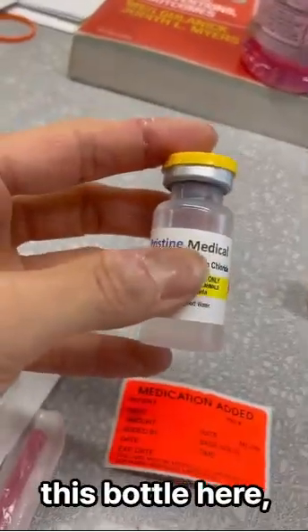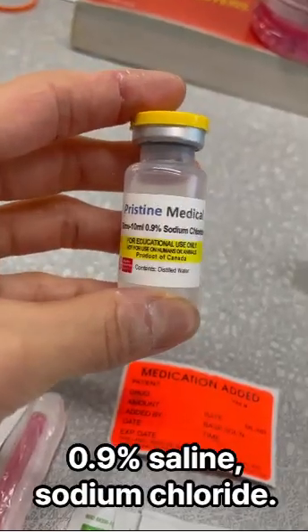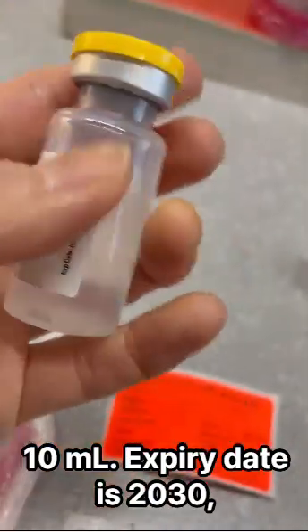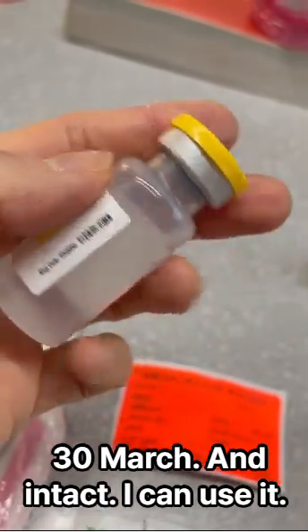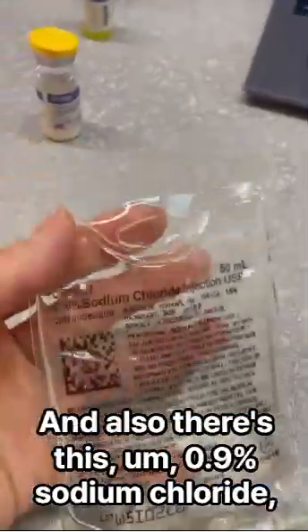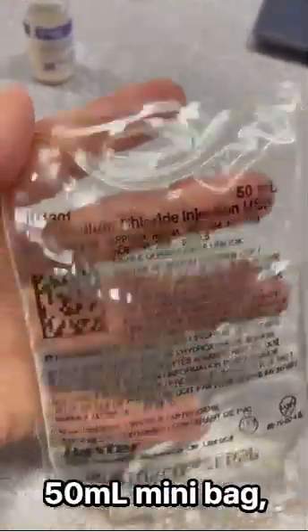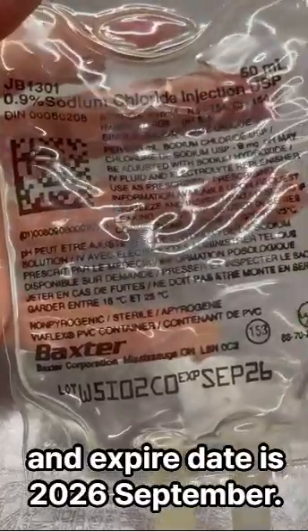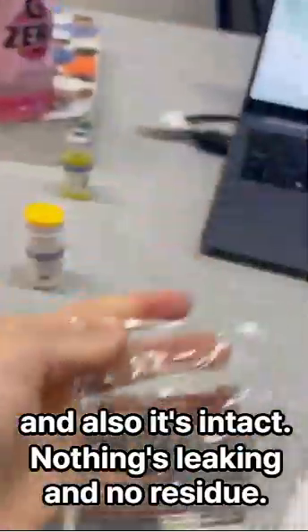And this bottle here is 0.9% sodium chloride, 10 milliliters. Expiry date is 2030 March, and it's intact, so I can use it. And also there's this 0.9% sodium chloride 50 milliliter mini bag, and the expiry date is 2026 September, and it's also intact, nothing's leaking and no residue.